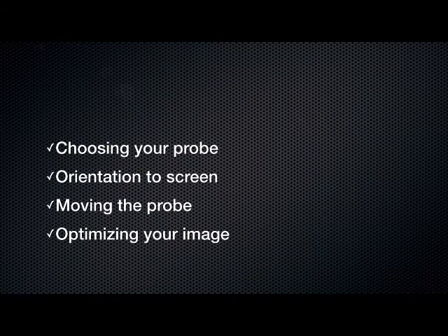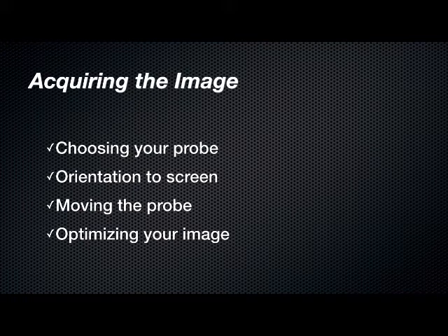When it comes to choosing the probe that you want and actually getting the image of the structure that you want, you first need to make sure that you're using the right probe. If you're doing something superficial, you're going to be using the high frequency probe. If you're doing something deep, you're going to use the low frequency probe.